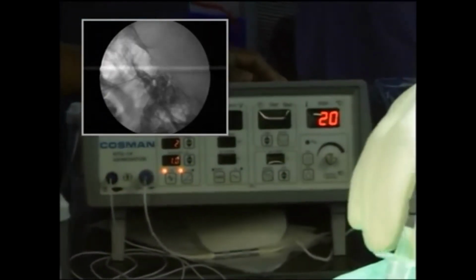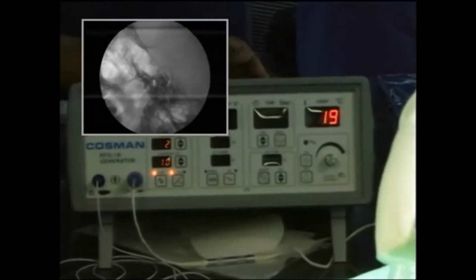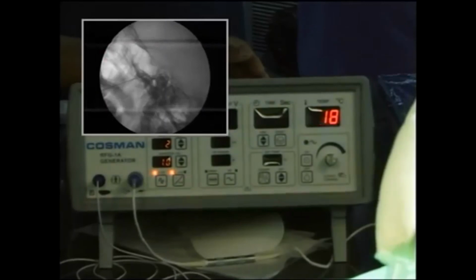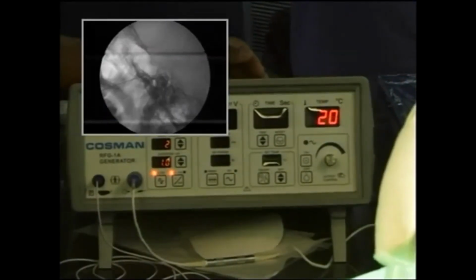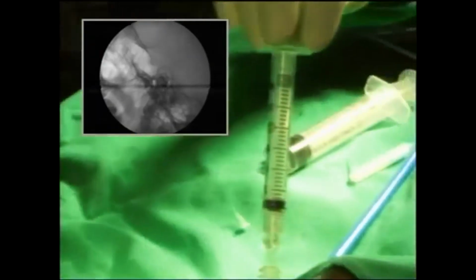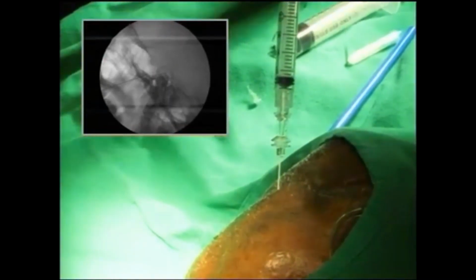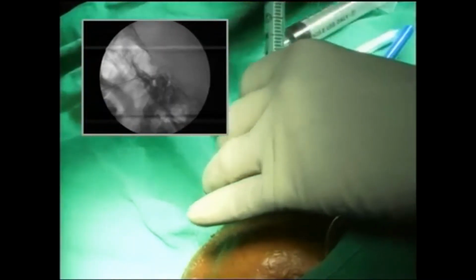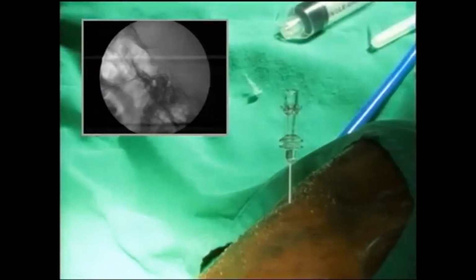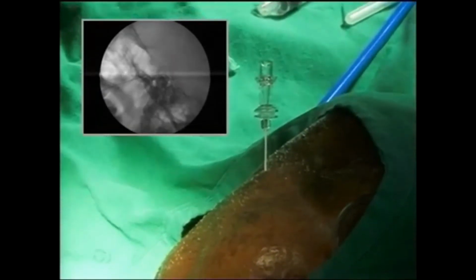Karthik, we saw some CSF coming out. Yes, I'm doing a negative aspiration. After that, I've withdrawn the needle. I'm doing a negative aspiration right now. Can you focus on this one second? So I'm doing a negative aspiration now. Can you see? Nothing is coming. Needle disconnected. Nothing is coming. Good. Great. Give some more sedation.